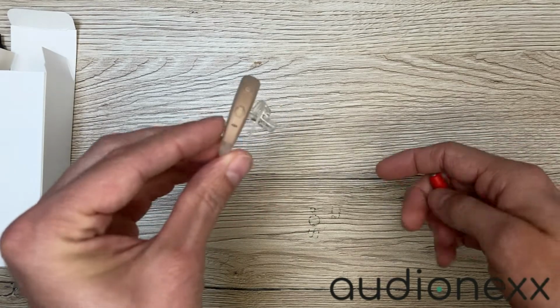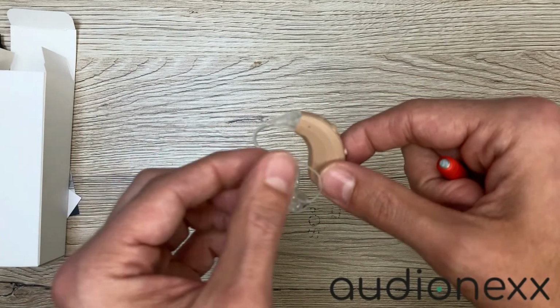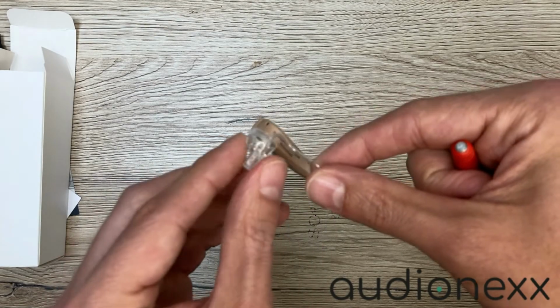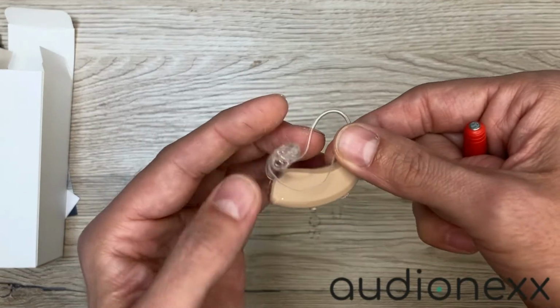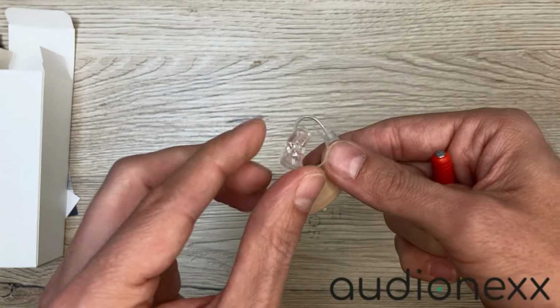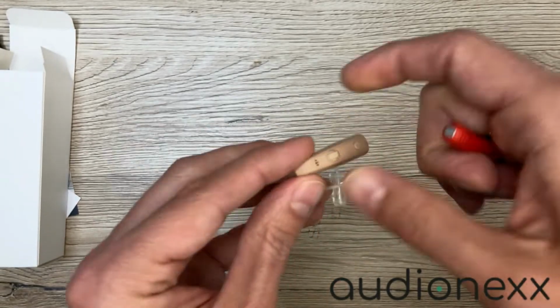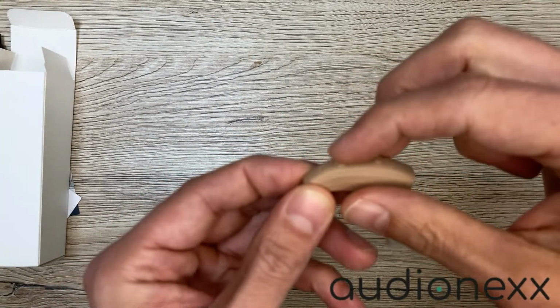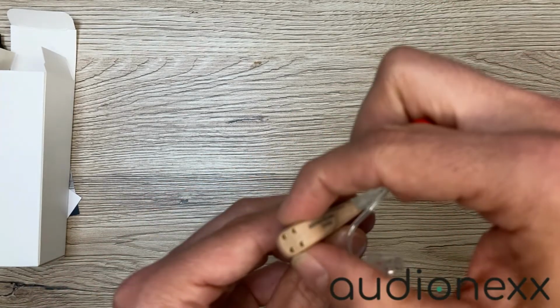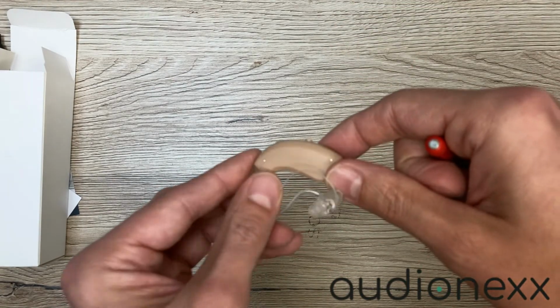We can see a behind the ear hearing aid. It's honestly pretty huge, even for a rechargeable hearing aid. Then this is a slim tube. It's not a receiver in the ear hearing aid, but you have a slim tube here, which is good if you have plenty of earwax because it's easy to clean. We have an ear tip here, a retention, and of course here, one microphone opening. This is for adjusting the gain. This is probably for switching the hearing programs. The charging contacts are here.